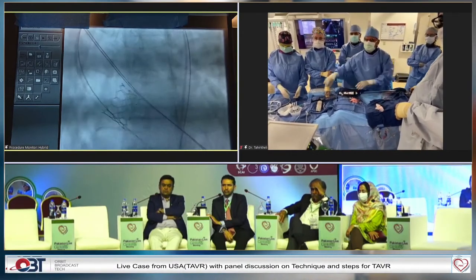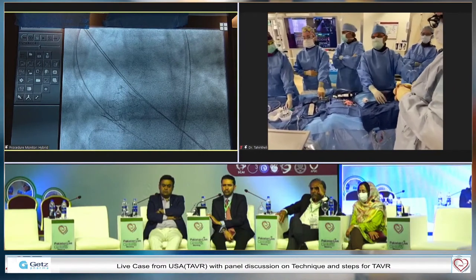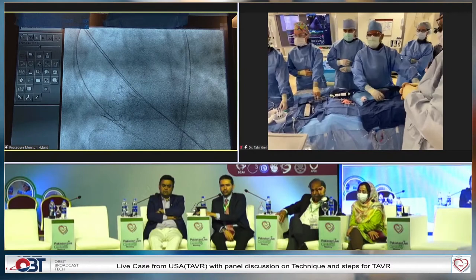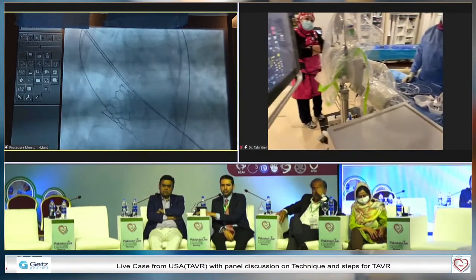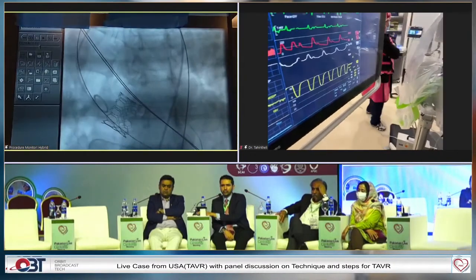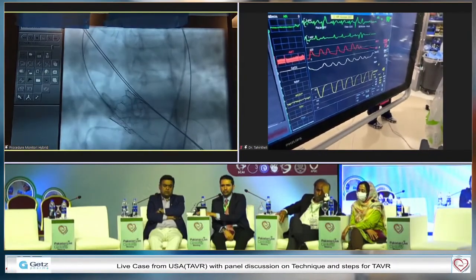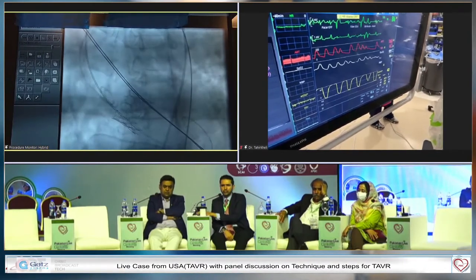Our blood pressure is okay. Can you show the hemodynamics? If not, just do the other. Go ahead. We'll repeat one, just for the audience. So you see it, it's pretty perfect there. Pretty good. About 90-10. We'll shorten a bit more on the left side, but it looks pretty good.